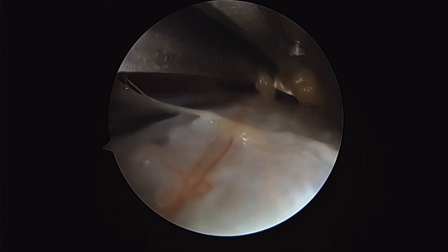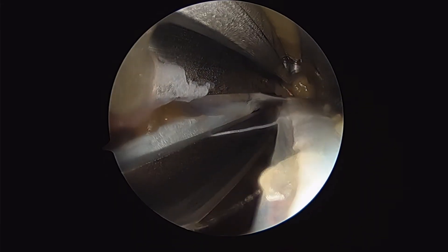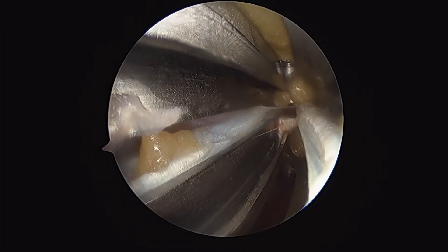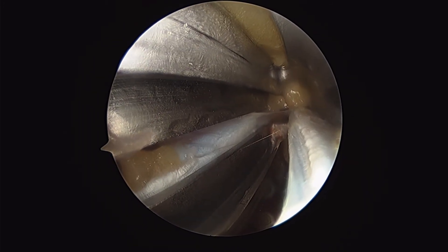Now I can just advance my guide further to give me a little bit more fascia in size here. And once I've reached the proximal and distal aspects, I'm able to put my fingers in the incisions and ensure that I've got complete release of the fascia. You can see we really have a nice dry field, and we have clear visualization the entire time.